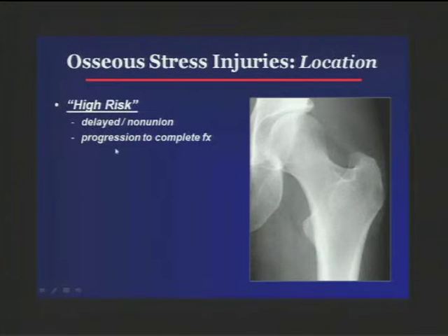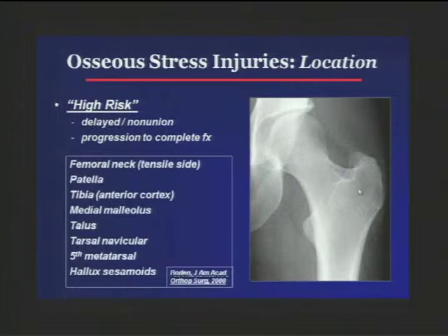It's important to know where the dangerous stress fractures occur, and in the hip, that's along the lateral margin, the tensile side. This is a list of those that tend not to do well around the body, but the one I want to focus on is this, because, like we were talking about in the elbow, when you weight bear, because of the shape of the femur, this is known as the tensile side because it's trying to kind of arc on that convex appearance.